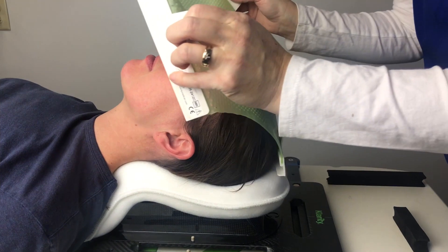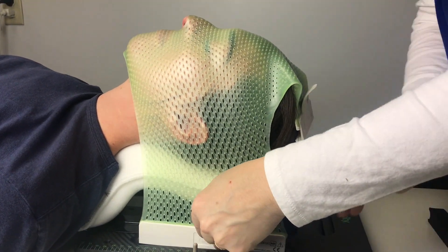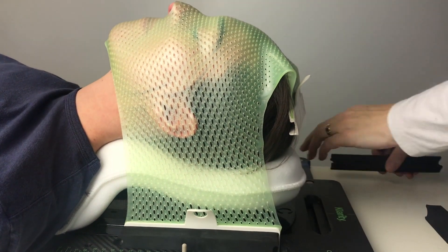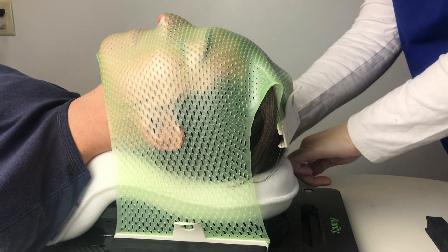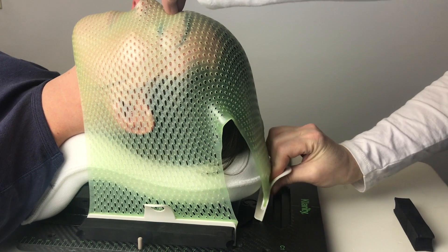Once the mask is ready to be molded, line the nose hole up on the patient and pull evenly down on both sides. Clip the frame into the base plate and secure using the foam wedges. Once both sides are secure, hold the bridge of the nose and pull the last clip and secure the same way.